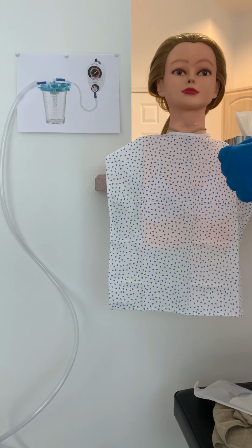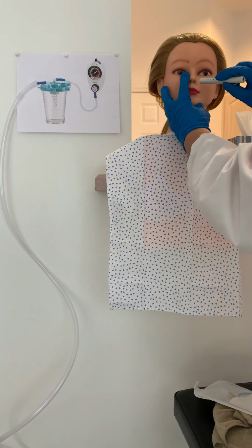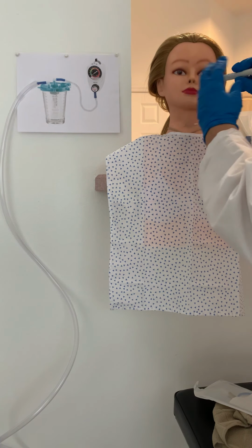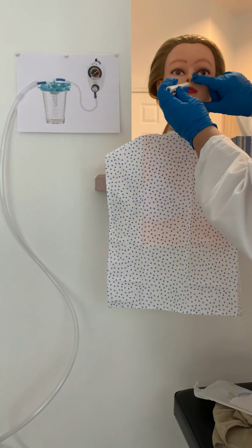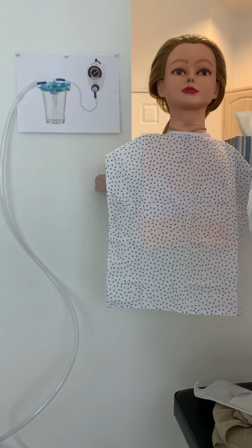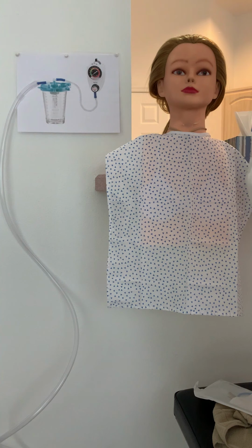Okay, Mrs. Harper, I'm just going to look in your nostrils and have you take some breaths and see which nostril we should go down. So I'm going to plug this side, and can you take a sniff in for me? Okay, and then I'll plug this other side, sniff in. Okay, can you tell me which side you feel like you breathe better out of? This side? Okay, so I'm going to go into this side through this nostril.